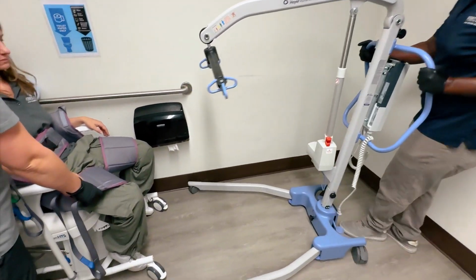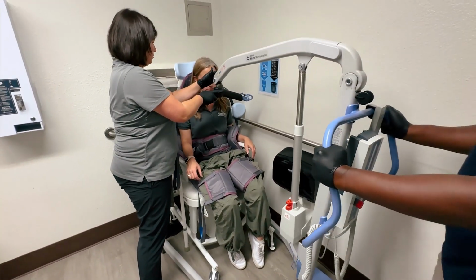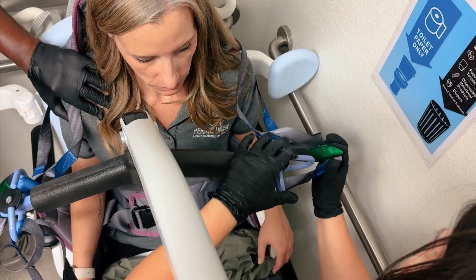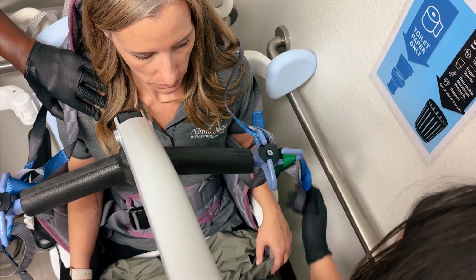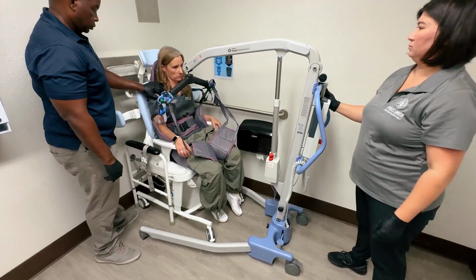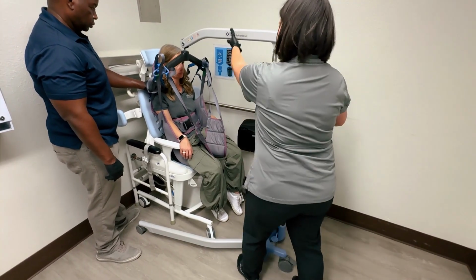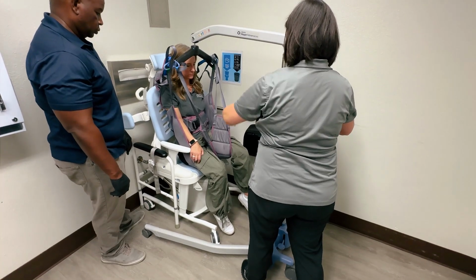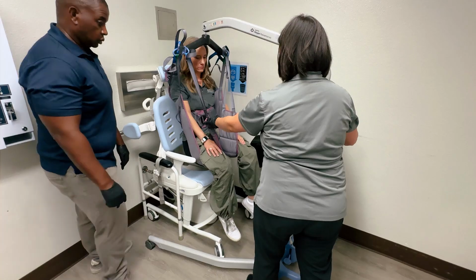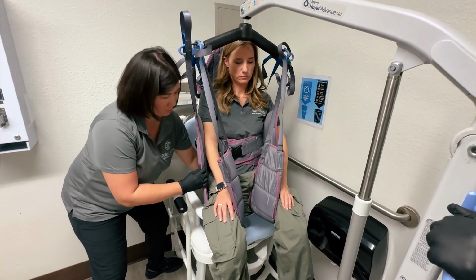Hook the loops of the sling back onto the Hoyer lift. Check that the sling is comfortable for the student and safely secured. Begin lifting the student. When the student is a few inches above the toilet, additional wiping can be done easily if needed. Wash hands and change gloves after assisting with wiping the student.